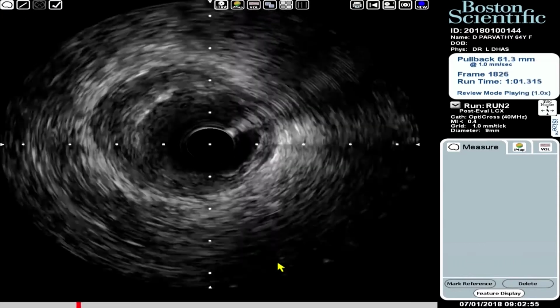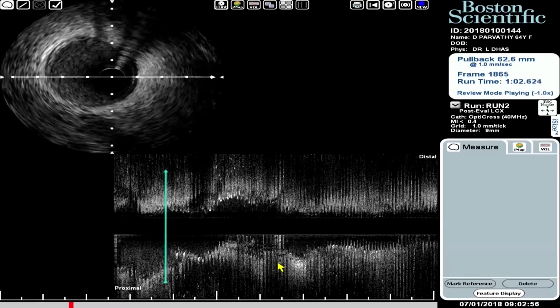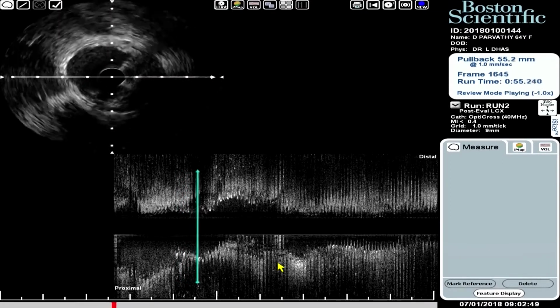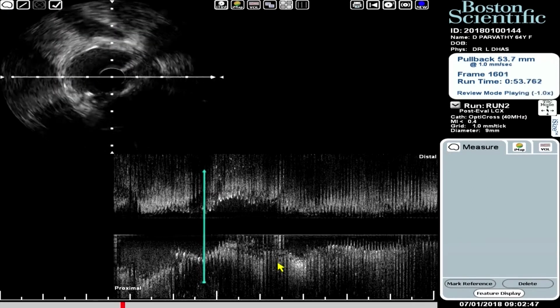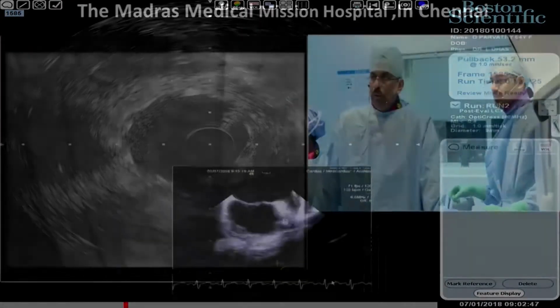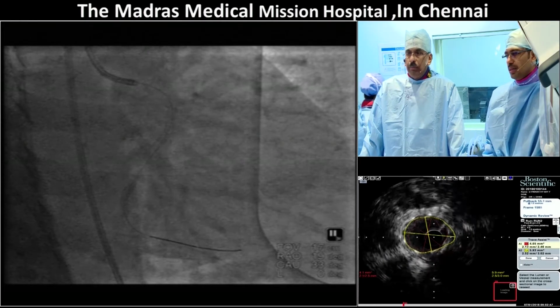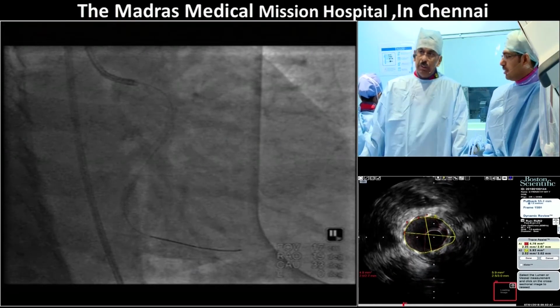Can we have some questions, Benjamin? Yeah, Ajit, would you have chosen a single stent to cover both the lesions? The problem was that there was a mismatch. Yeah, absolutely. It's a 2 millimeter vessel distally, and it's a 2.75 in the proximal, with almost a 3.0 in the proximal part of the proximal lesion. So if you have to put something, it will be a long tapered stent, landing with 2.25 distally and maybe reaching a 3.0 on the proximal.